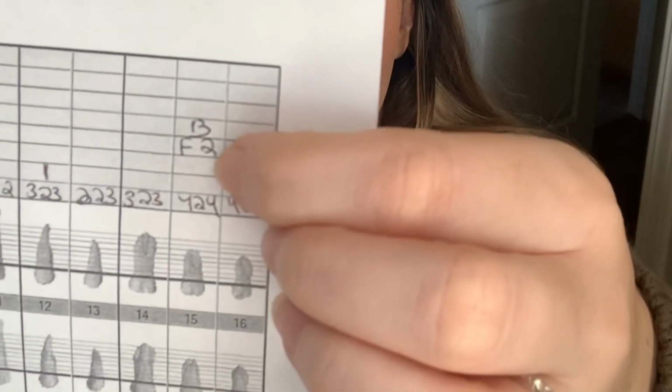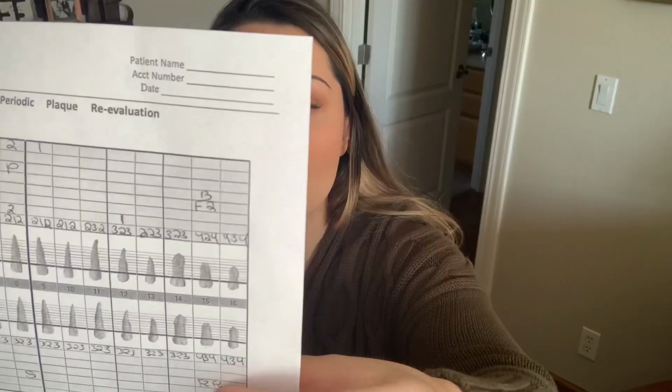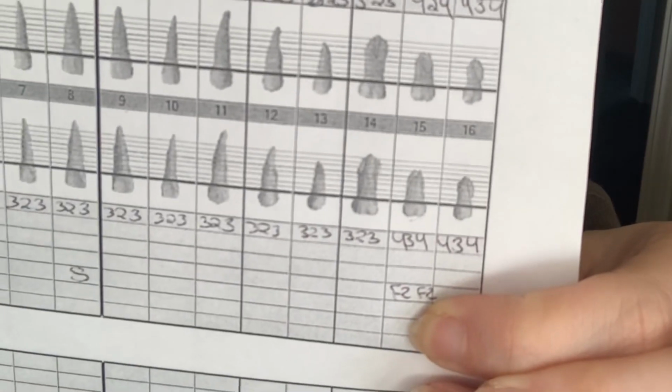The facial side of the molars is going to have 1 reading, and it's going to go right into the center. So like on here, I put number 15 on the facial side has F2 as the furcation. But on the lingual side, there's going to be a distal and a mesial reading. So there are actually 2 different measurements for the lingual side. And that's because a molar sometimes has 3 roots, right?